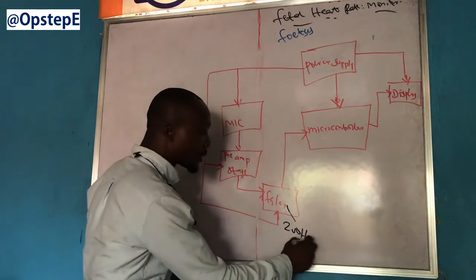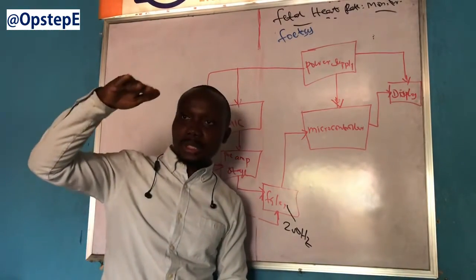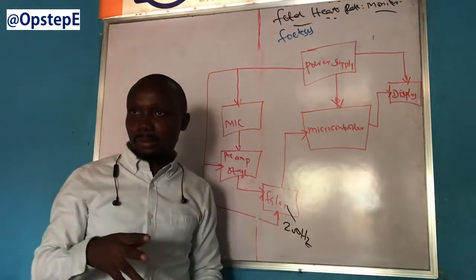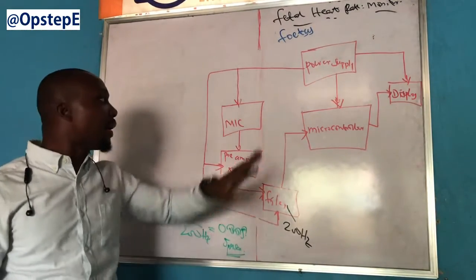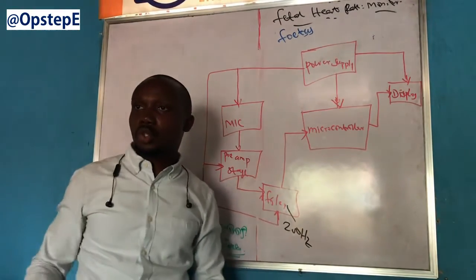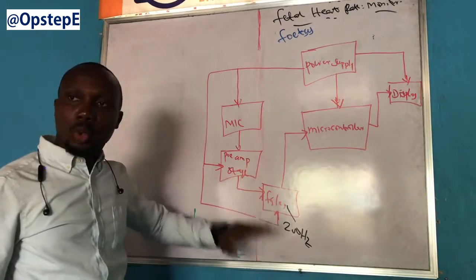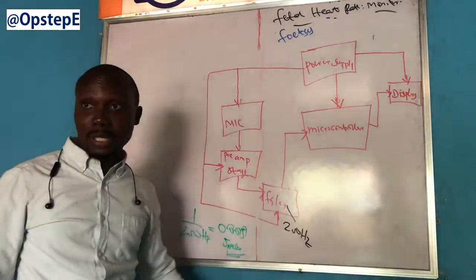Outside 200 Hz, which will be the frequency bandwidth or range in which the human voice or sound made by a woman can resonate. The microphone will receive everything. The preamp stage will amplify everything the microphone is receiving. The filter is just there to help us sieve out some sound outside this range, so that what we now have will be every other thing below or within the range set by the filter.